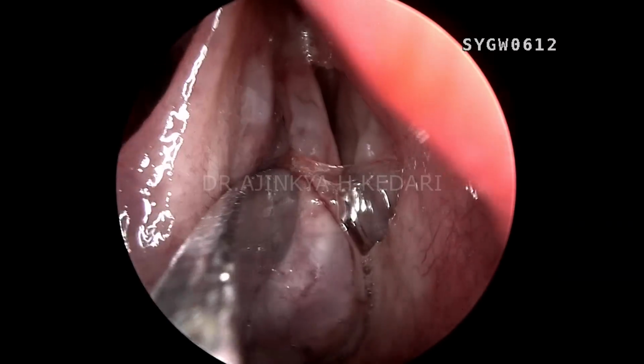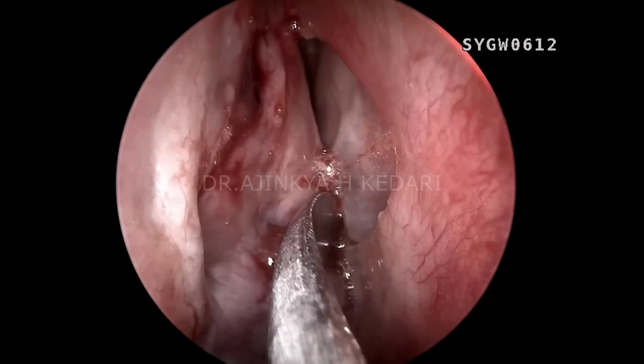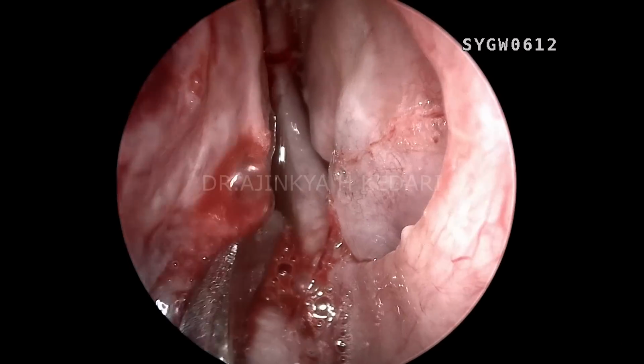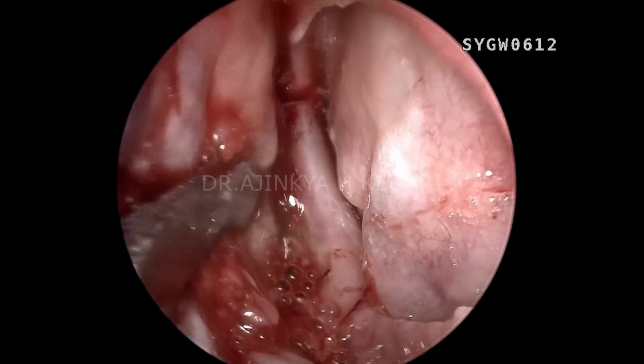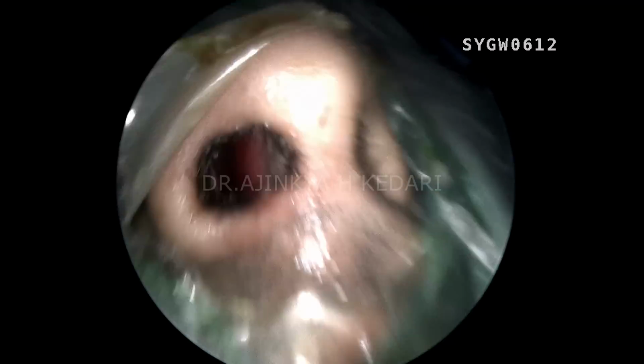So what you can see me doing right now is I'm trying to do the lateralization of the middle turbinate, and along with that the superior turbinate as well. But while I'm doing this, what you can observe here is there's a huge superior septectomy which has already been done on this patient.